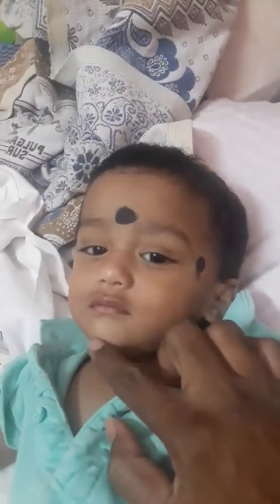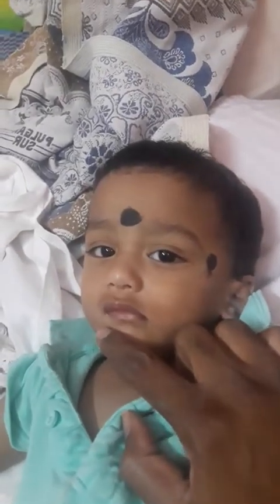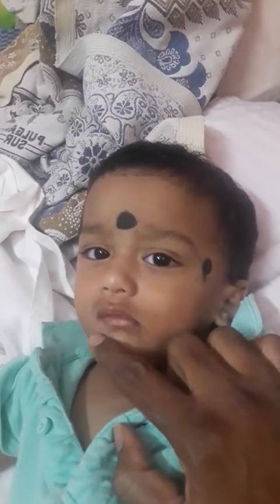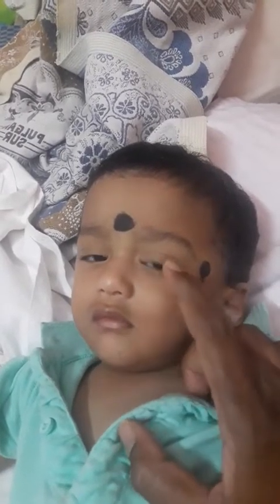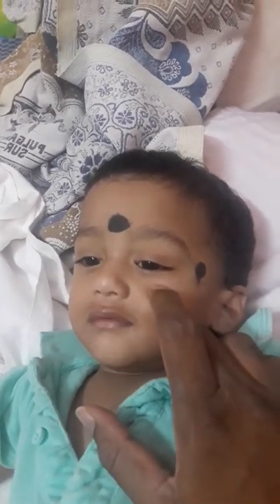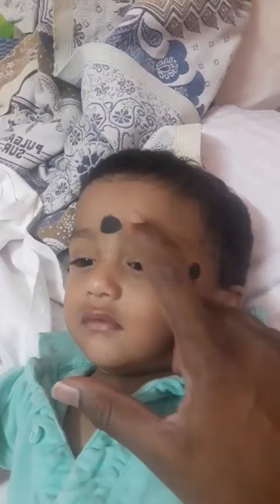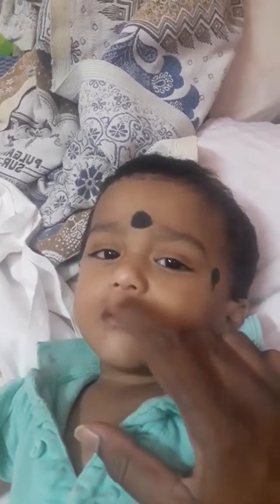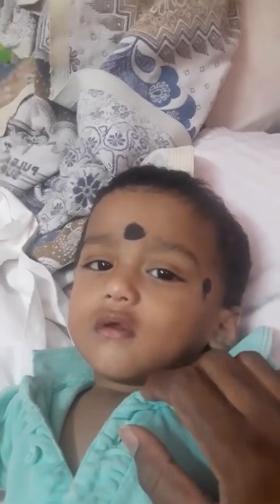Okay, so once again I am repeating. Once you remove the sphenoidal keel, like we see a baby's eyes when we see a baby, similarly we have to see the LOCRs. Baby's eyes are the LOCRs, lateral optico-carotid recesses. The optic nerve is the eyebrow. The cheek is the paraclival carotid. Mouth and nose are the pituitary. Okay. Thank you.